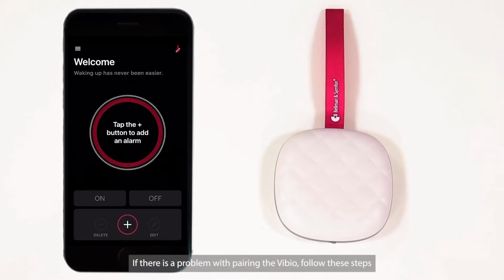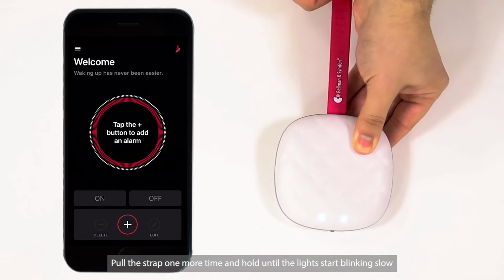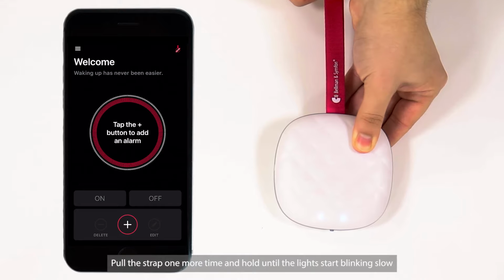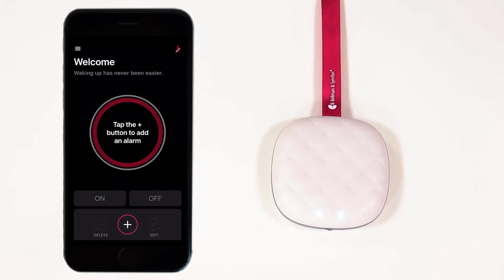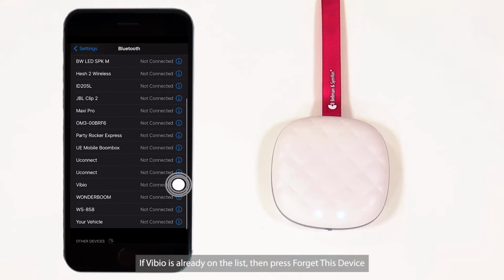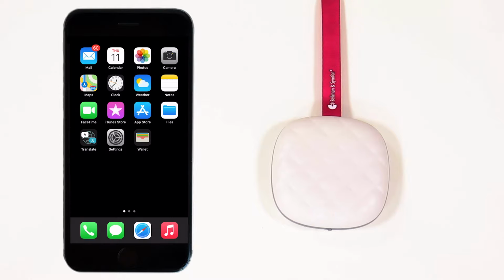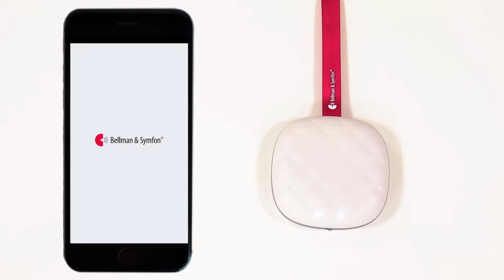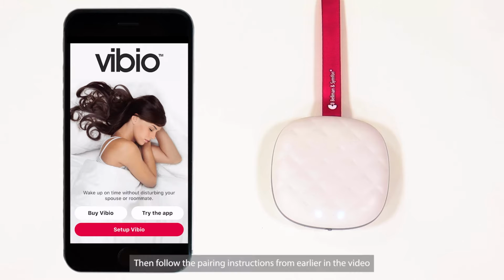If there is a problem with pairing the Vibio, follow these steps. Pull the strap and hold until you see the lights blinking fast. Pull the strap one more time and hold until the lights start blinking slow. Now Vibio has cleared its memory and has re-entered pairing mode. Go to your settings and turn on Bluetooth. If Vibio is already on the list, then press Forget this device. Now go to the Vibio app, go to the menu, and select Set up a new Vibio. Then follow the pairing instructions from earlier in the video.